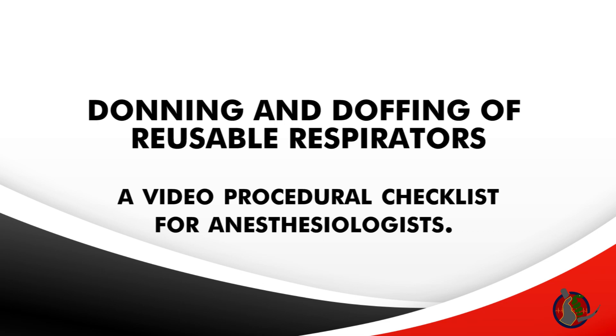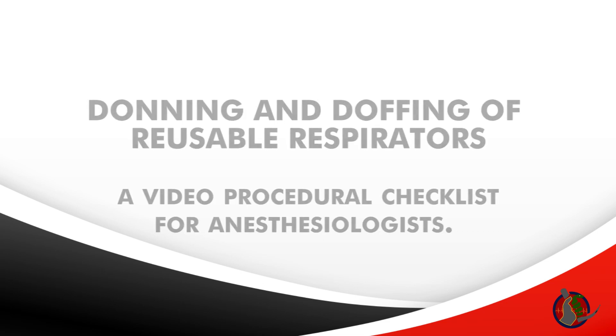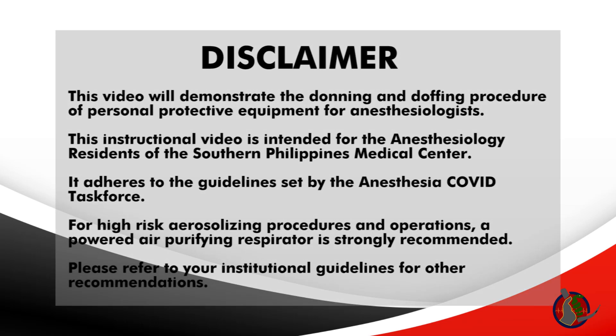This video will demonstrate the donning and doffing of reusable respirators. This instructional video is intended for anesthesiology residents of the Southern Philippines Medical Center. It adheres to the Anesthesia COVID Task Force guidelines for high-risk aerosolizing procedures and operations.